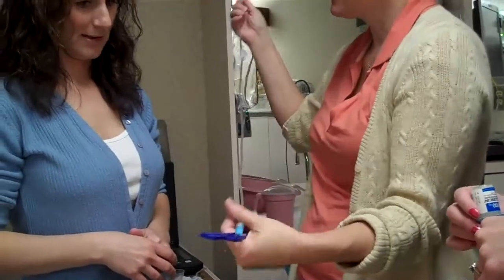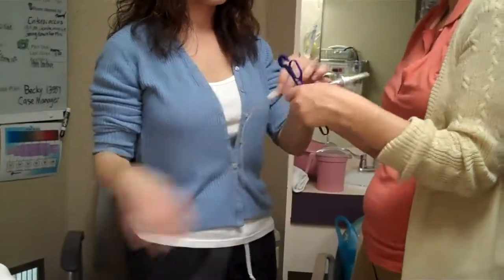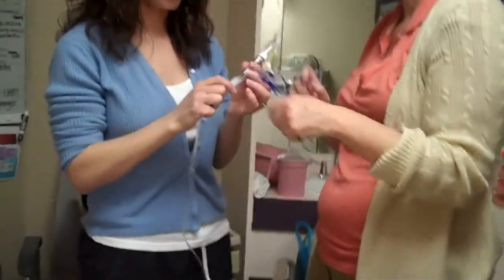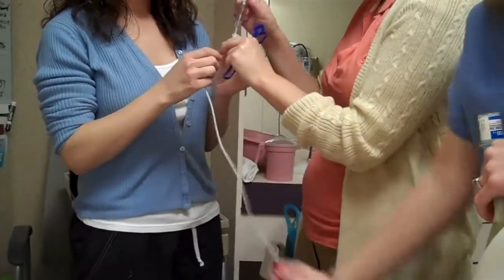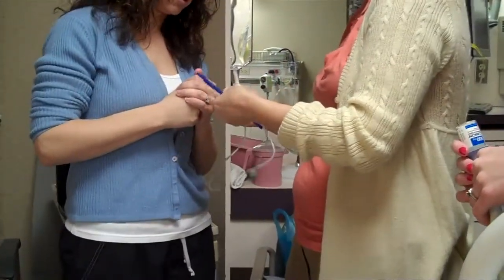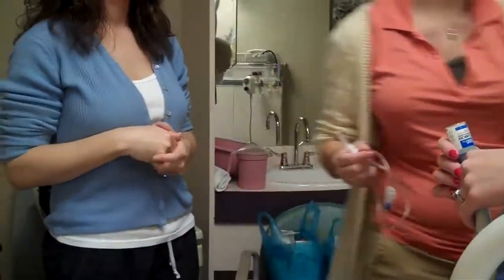So here's your tubing, and you can see that it's not clamped. So the first thing you want to do is clamp. You just roll the clamp down, and you're just closing it for the medication. Because if you spike your bag without a clamp, it'll go all over the place. You can put it anywhere on this line. And then you just roll it. Squeeze it. Now it's closed and it's not sliding.